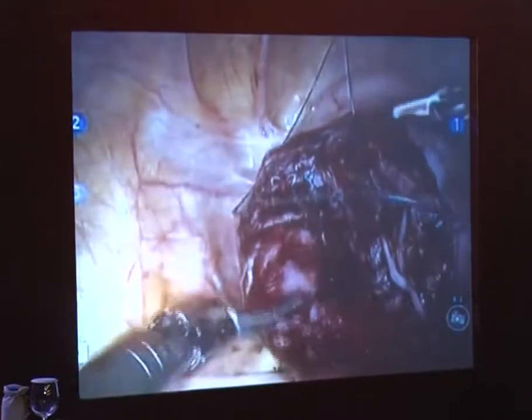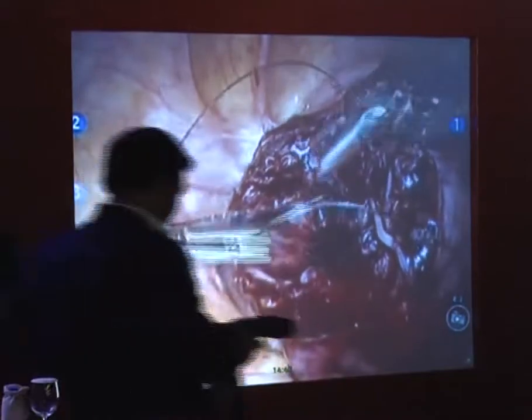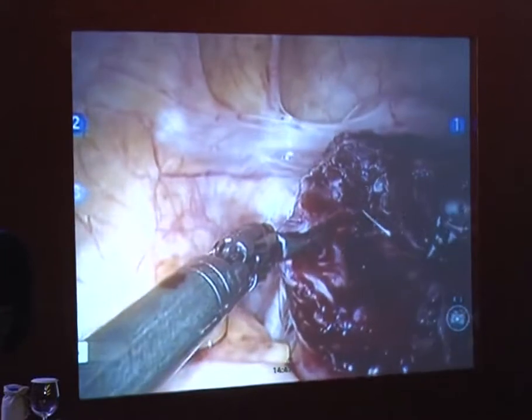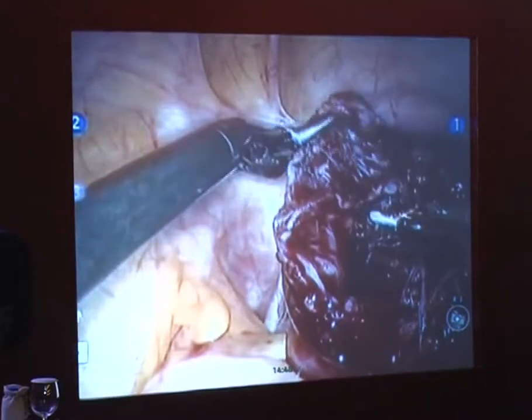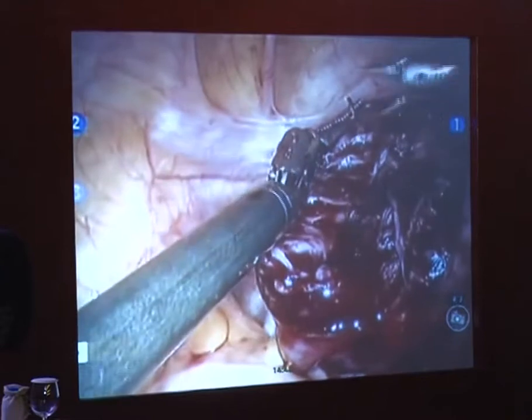By the way, notice that with this V-lock, if you've never seen it before, it has an eyelet on the end. Once you take your first bite, you have to thread the eyelet like I did here. And then instead of pulling it through, I automatically go ahead and take the next bite. And then I pull it through. This allows me to save a step.